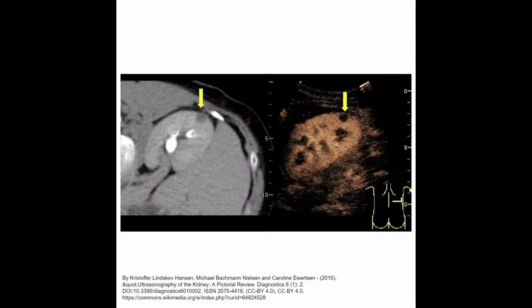I had mentioned earlier that for other organs in the US, it's not really very popular quite yet, but it has been used quite widely in Europe and in Asia. So for other organs like the kidneys or the liver, we can again inject the contrast agent in through an IV. It's going to travel through the heart, go through the cardiac cycle, and then eventually that blood is going to perfuse into the organs, into the kidneys, into the liver.